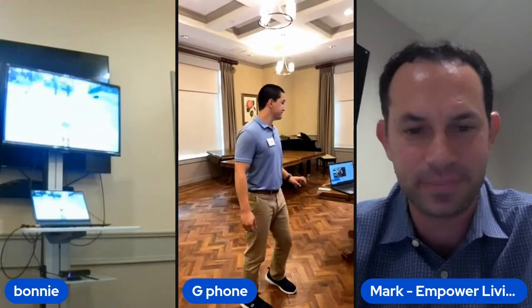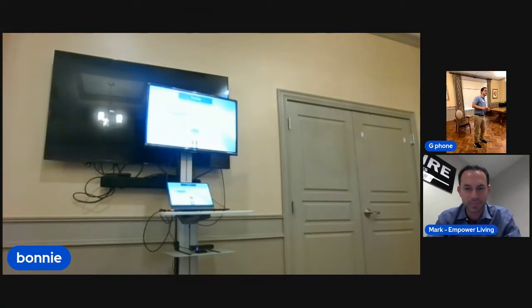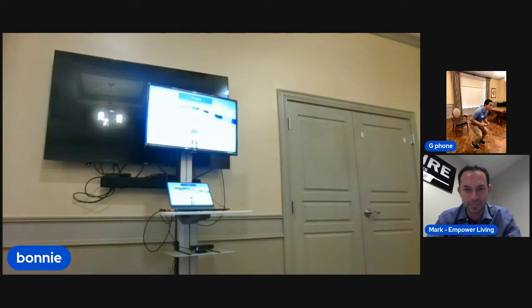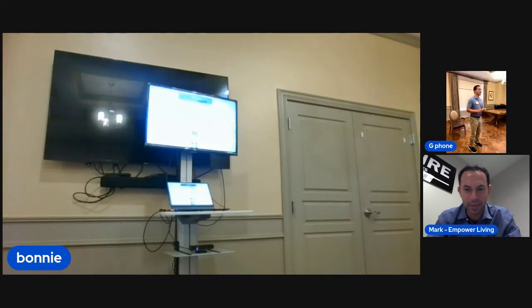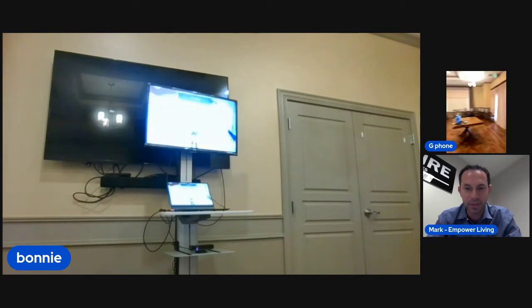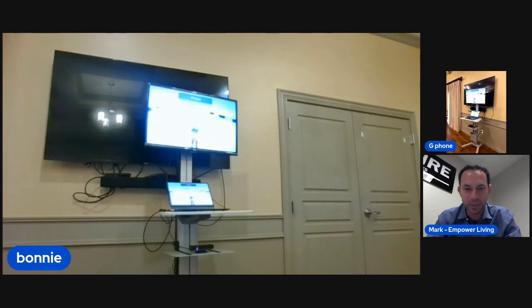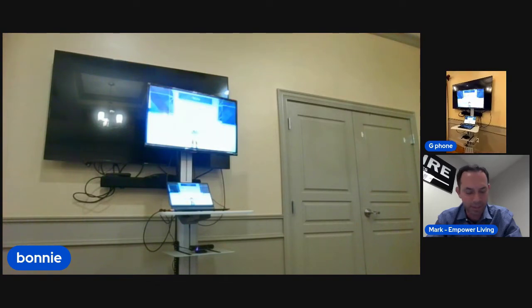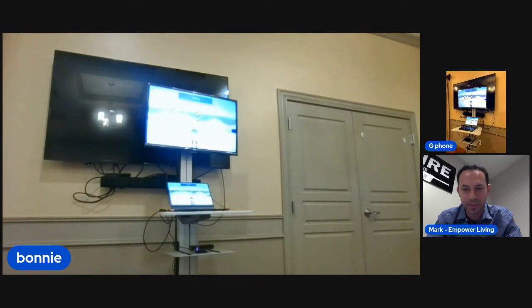All right, so this is skiing. So you can see Gunnar doing some lateral movements here, just picking up on the ski slope as he goes down. Bending, doing these games with our partners, Rise Senior Living, there to watch you. If our resident or the user is going to be bending improperly, we have someone there to correct the bend. You don't want the knees to go past the toes when you bend. But again, it's movement, so we like to see that as well.